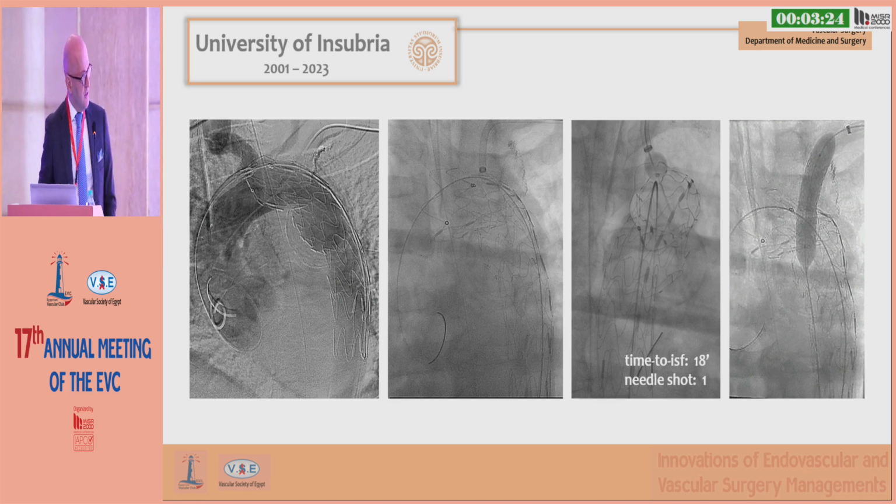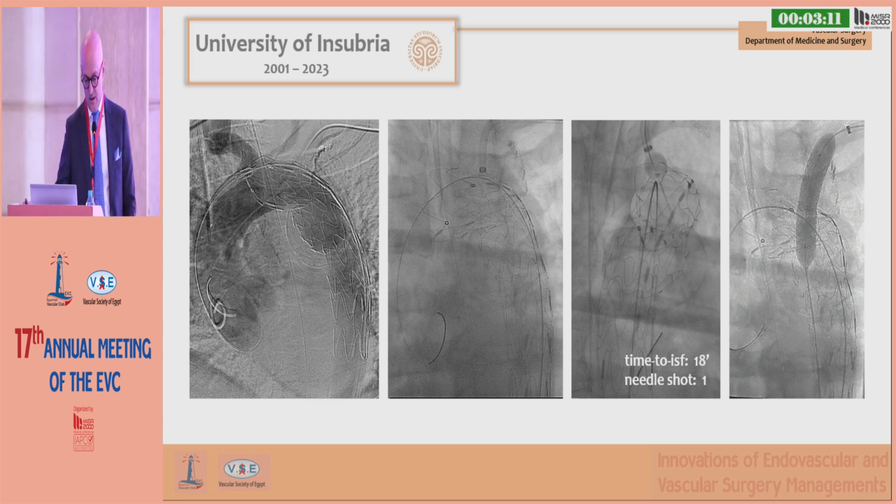On the left-hand side, you can see the partial opening of the Ancora stent graft, where you can see quite magnificently the radiopacity of the marker that leads you at the proximal edge deployment. Here you can see how important the perpendicularity of the left subclavian artery takeoff is, to make the most efficacious and the safest puncturing of the endograft.